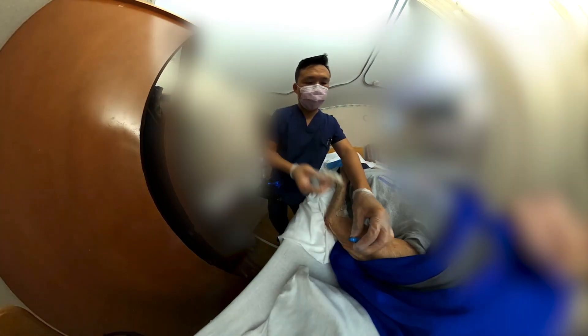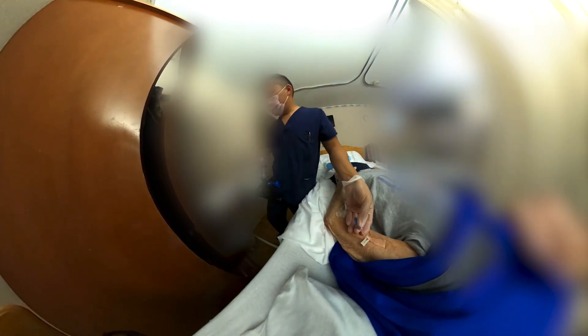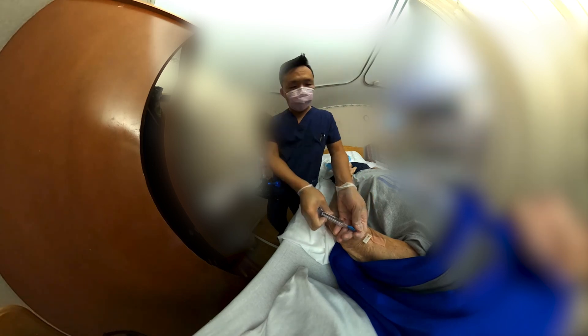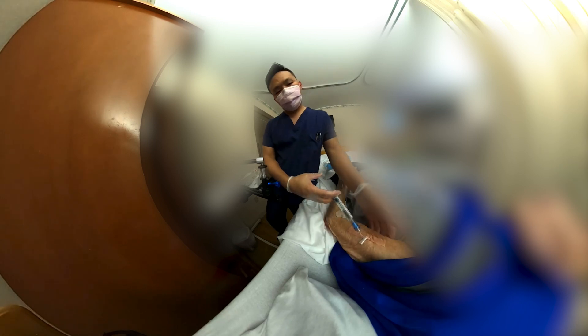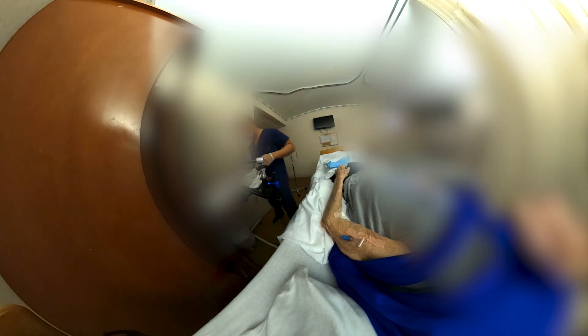Because it's such a weird placement, after I finish dressing it I'm going to do one more check. Look at that — good, no resistance, no sound, no infiltration.